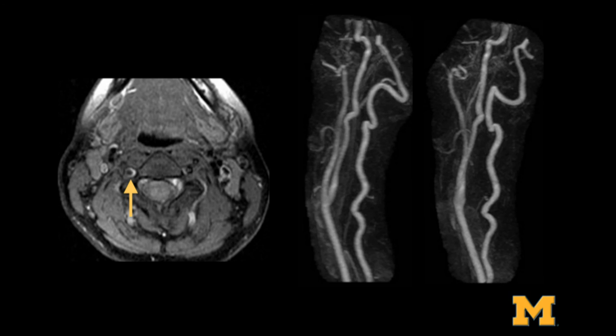So here we have some T1 shortening. And what this is actually is fat suppression artifact involving the vertebral artery. So if you are doing MR for dissections and you are doing fat suppression, realize that you can end up getting a fat suppression artifact in the walls.